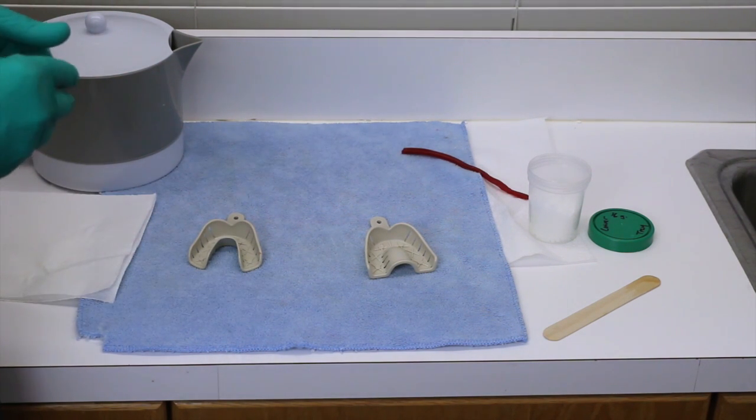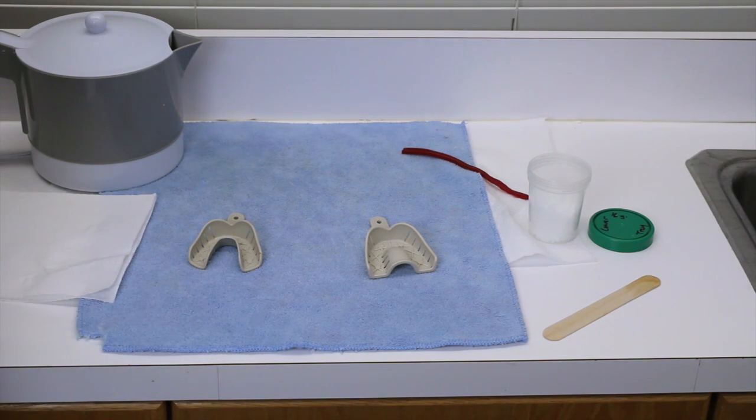One of the things we need to understand about border molding is that if we're using a soft material, we're going to demonstrate the use of a utility wax, we need to understand there is a potential for distortion when that impression is removed from the mouth. Because of that wax being not rigid, if that happens to be bent a little bit, it can certainly distort the impression. So if we're really concerned with having very, very accurate details of those areas that we are border molding, we're going to want to use the rigid material, the tack, which we'll demonstrate here.